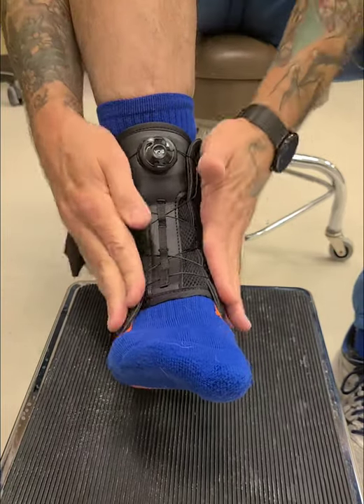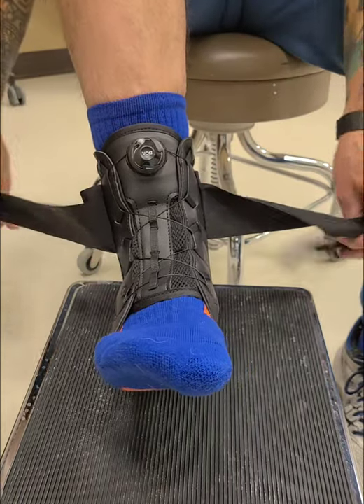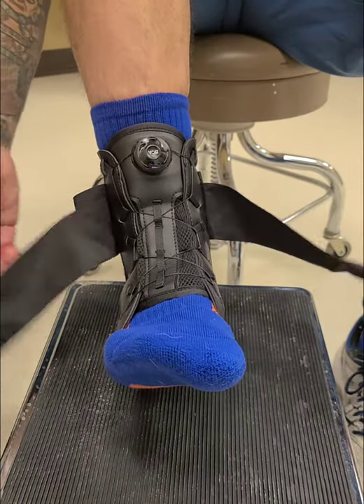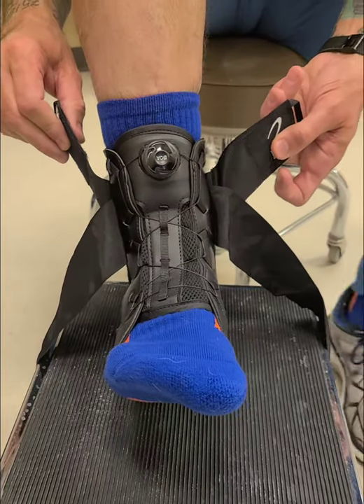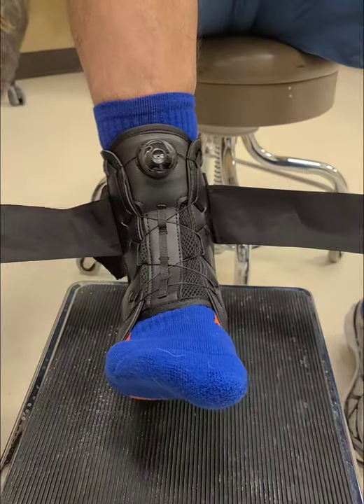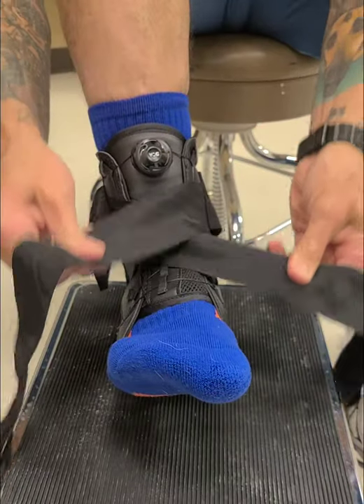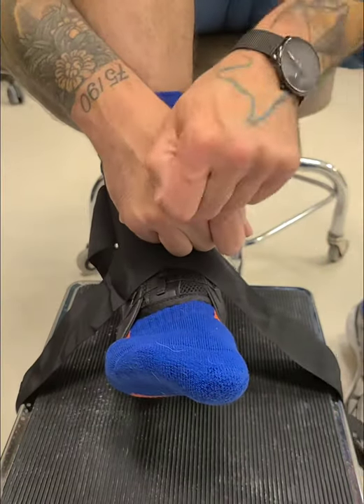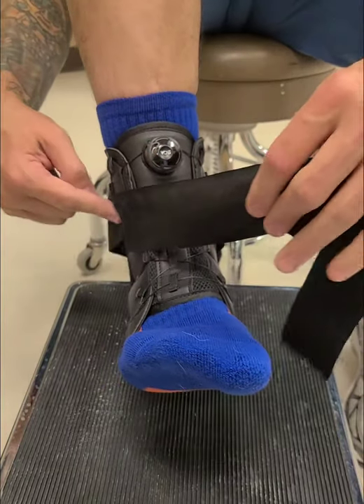There we go — looks like everything's pretty straight, good to go. Now I'll show you how to do the main support straps. We've got two long straps here and two little ones in the back — they'll serve a purpose at the end but they just get in the way until then. These two straps crisscross over the front. It doesn't matter if you do left strap on top of right or vice versa, but whatever strap you start with, you start on the outside.